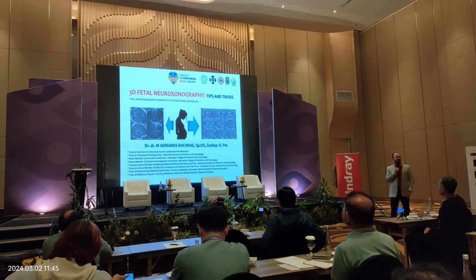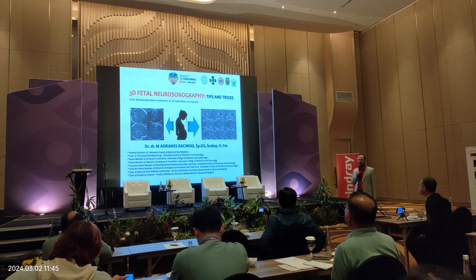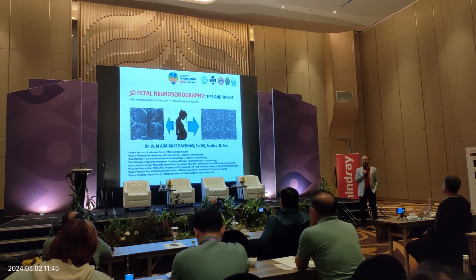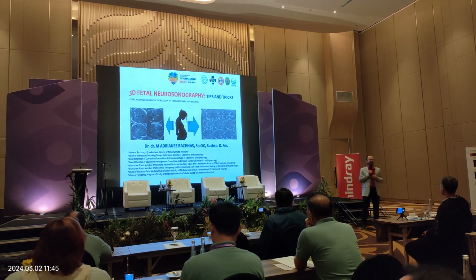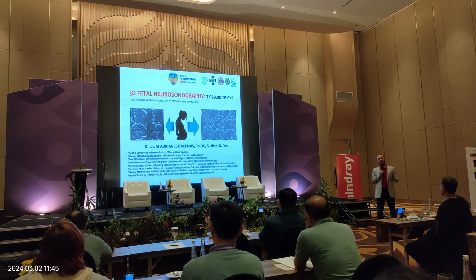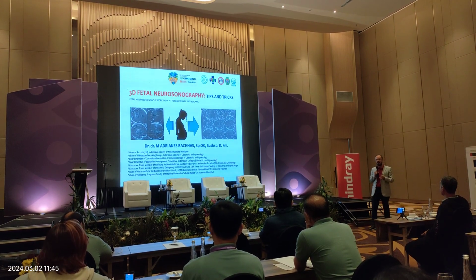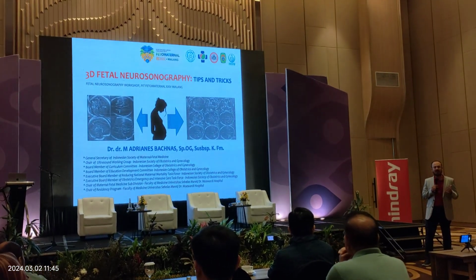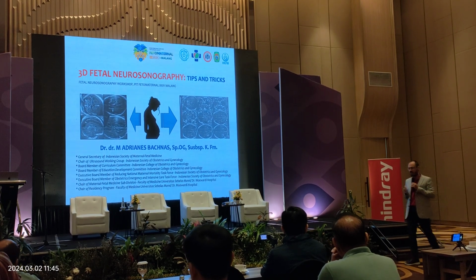Okay, dear colleagues, now I will present the next topic about 3D fetal neurosonography. I think this is relatively new for most of you. I know some of the participants here are already used to doing 3D sonography, but for most, we need to start from the very beginning: the fundamentals of doing 3D sonography, why we are not doing 4D or 5D, and the most influential tips for doing 3D ultrasound.